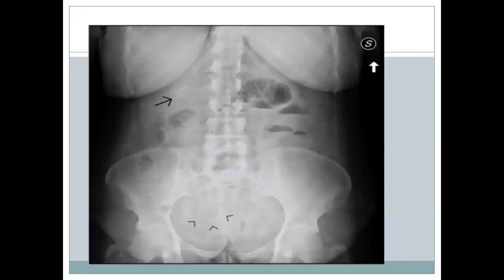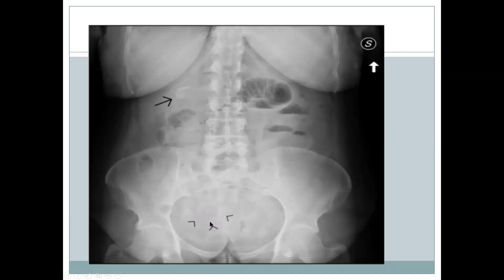Here is another erect abdominal X-ray showing fluid-filled small bowel loops in the left upper quadrant with air-fluid levels. If you look closely, there is a thin rim of calcification in the right hemipelvis — this is the gallstone causing intestinal obstruction. We cannot see any pneumobilia in this case.